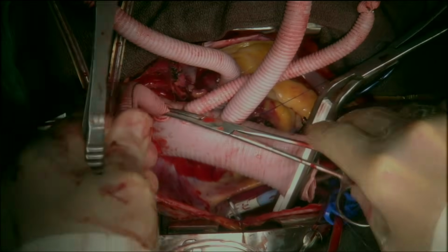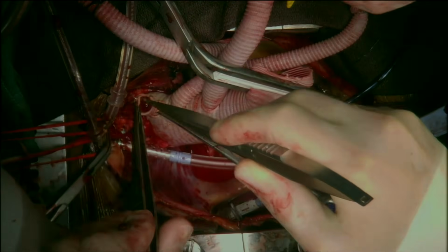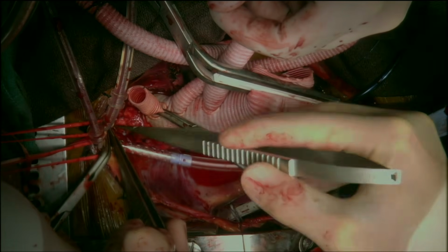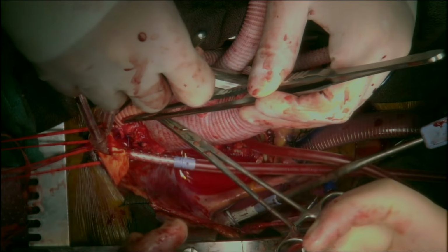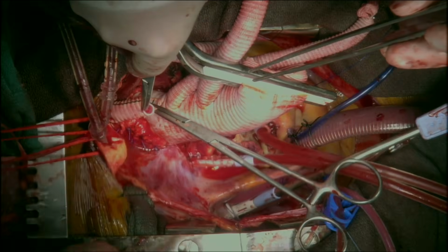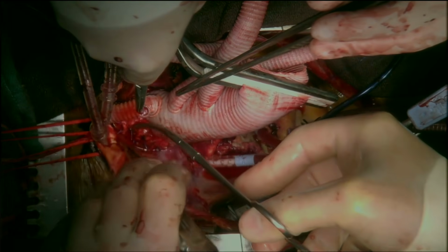The 10 millimeter side arm of the graft was clamped and trimmed. This was anastomosed to the left subclavian artery with a running 5-0 Prolene suture. The anastomosis was de-aired as the clamps were released. The patient was rewarmed at this point.